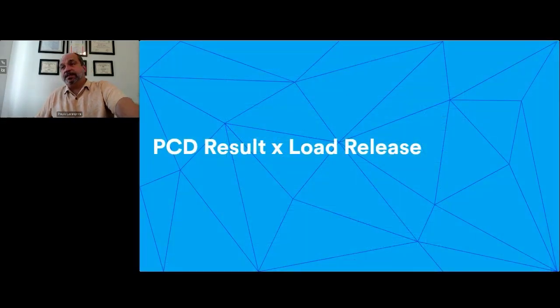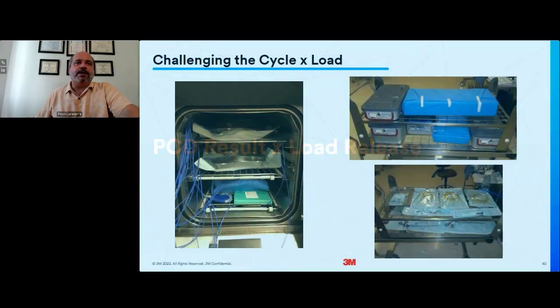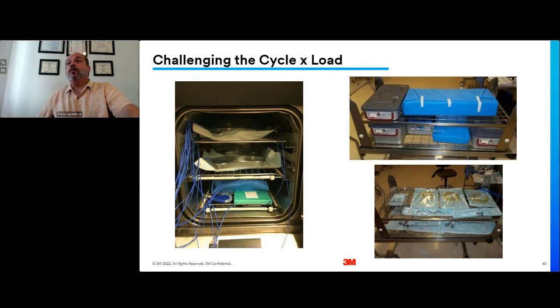Now let's look into the PCD result versus the load release. When I place my PCD correctly inside of my chamber, I will not be monitoring what I have in my load with the PCD, but I'll be monitoring the steam quality. I'm going to be monitoring those variables that my printout cannot capture. So when I have an approved PCD, it does not mean that the temperature was reached inside of my containers, for instance. I might have a type 5 inside of that container showing a failed result.